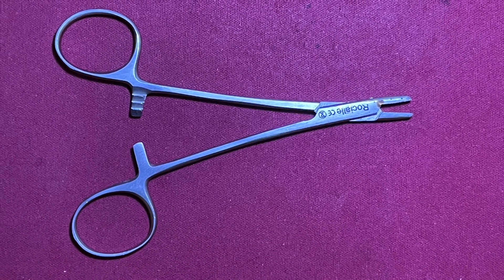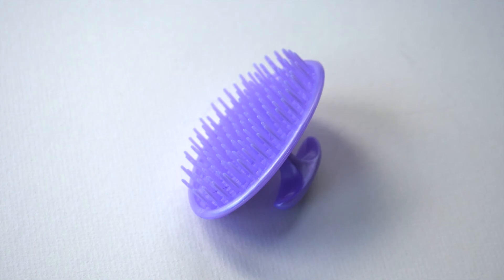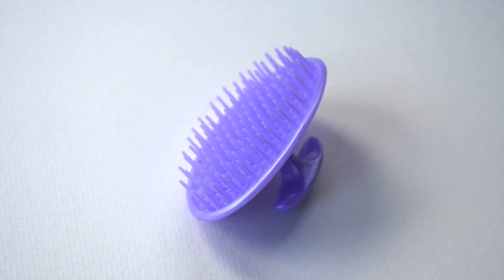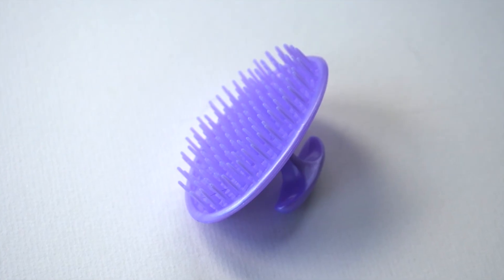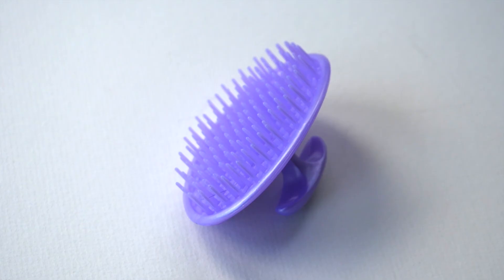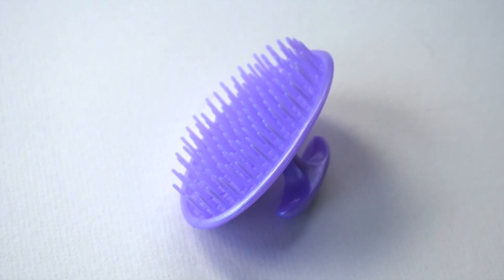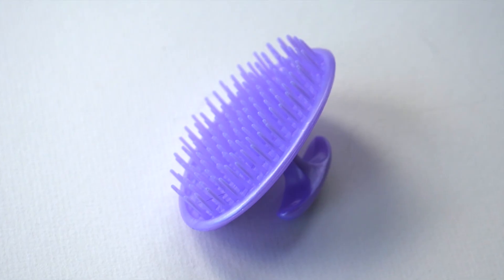The affected area of the scalp can also be rubbed vigorously with either a special disposable brush or even a new sterile toothbrush. The brush can then be sent off to the lab where it can be directly implanted into the culture medium plates.